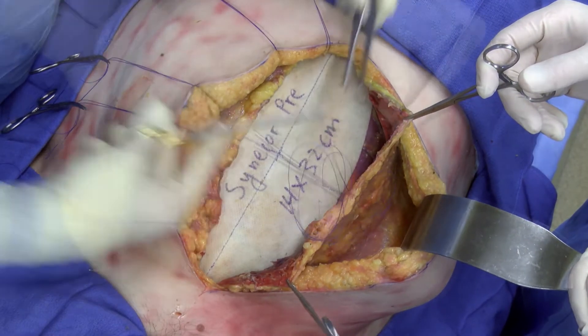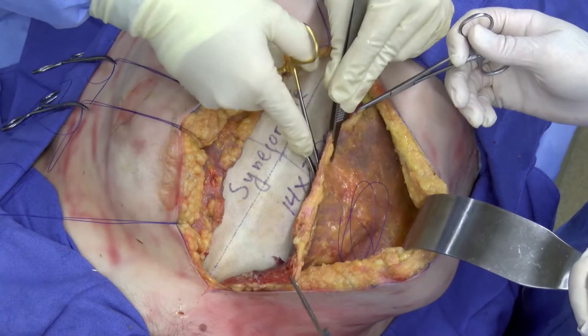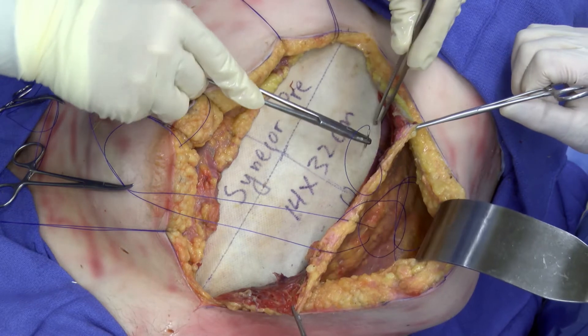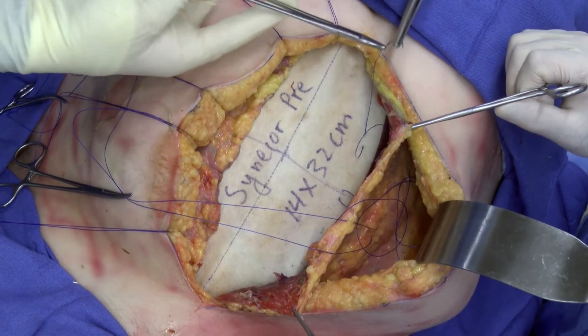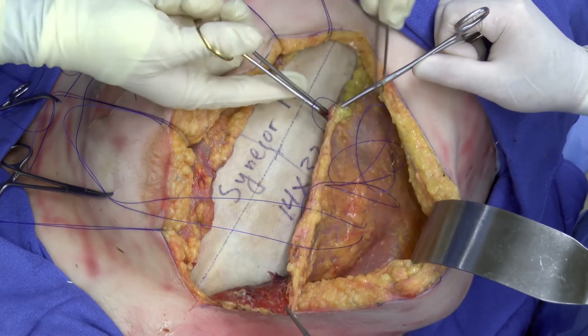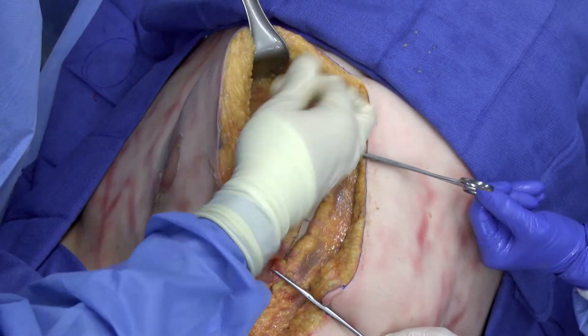The contralateral side is now inset in a similar fashion, and medialization of the rectus complex is ensured with each of the progressive transfascial sutures. Note that the axes of the mesh are unchanged during inset, preserving the appropriate orientation of the mesh.